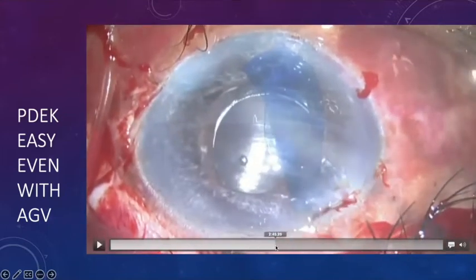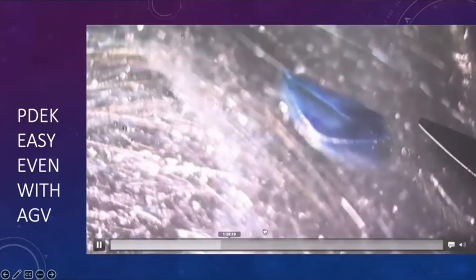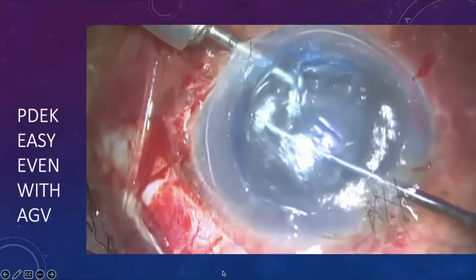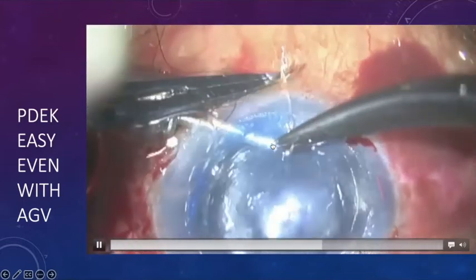So we've injected the graft into the anterior chamber. The PDEK is already here. Now, if you remember, I cut the graft here partly with a trephine and partly with a scissor. And when that happens, sometimes you can have a bit of stroma on one side. So there's this graft which also has some stroma, and I'm a little worried whether that area will detach just because it's heavier, so to say.